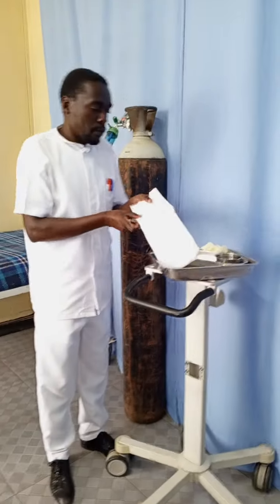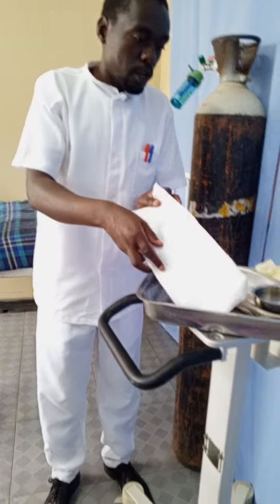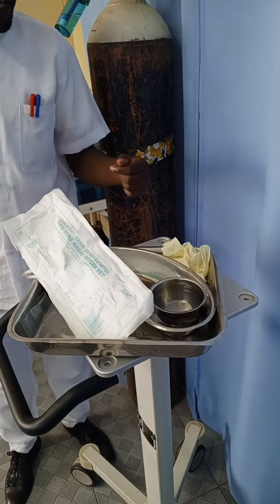I'll be back. When you go to prepare, there are some things that you need to use. We are going to administer this oxygen using an oxygen catheter, the nasal prong. You also need some water for testing. You also need a pair of gloves and some orange sticks. Now I'm going to wash my hands.